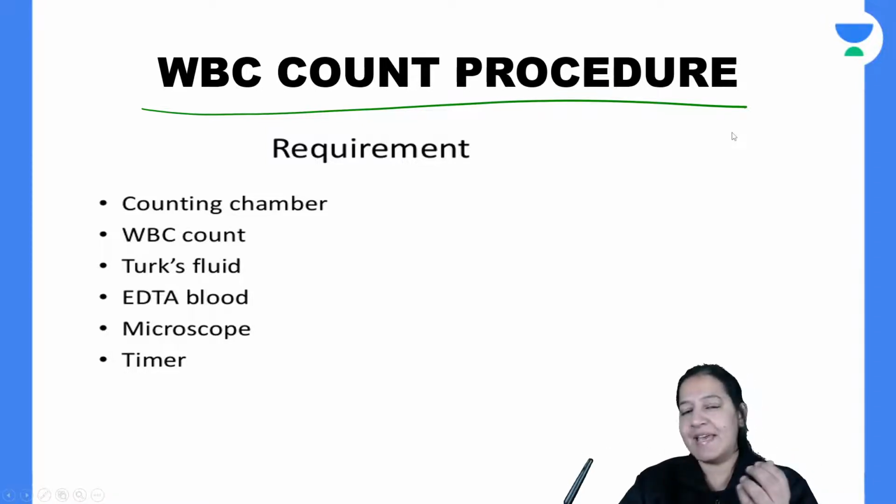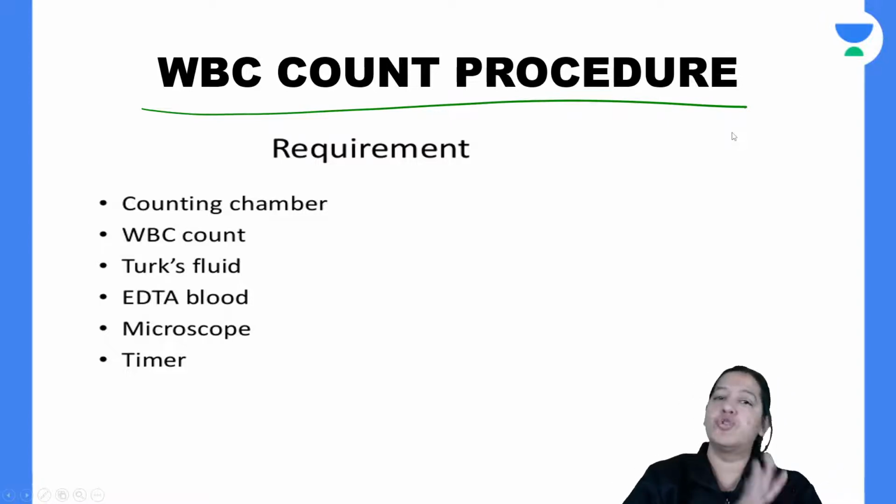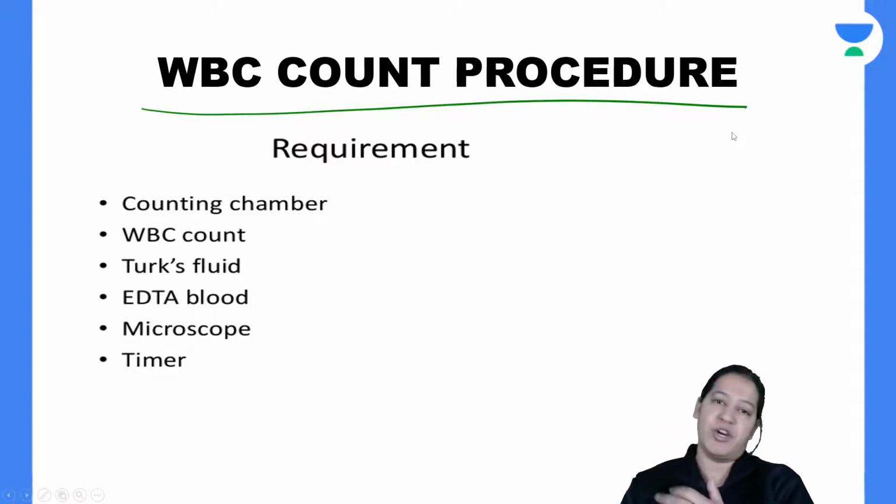यू नो न्यूबार्स देख के तुम्हारे हाथ में अनीमिया ल्यूकेमिया क्वेश्चन नहीं पूछेंगे, पहले पूछेंगे what it is, what is the use of it. So he uses RBC WBC count. So how you do it, tell me the procedure. Okay, what is the formula? Okay, RBC count कम हो जाए तो disease is known as anemia, तो anemia का classification और कुछ भी क्वेश्चन आगे रहेगा. Okay, WBC count ज्यादा हो जाए तो it is leukemia, तो ल्यूकेमिया का क्लासिफिकेशन और उसके आगे कुछ भी क्वेश्चन जा सकता है.